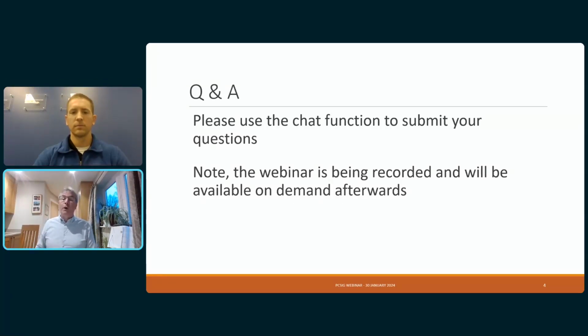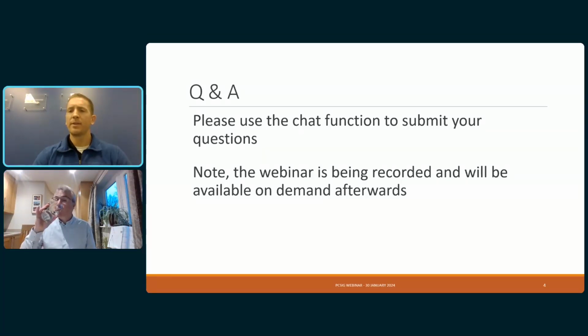A couple of questions from Matthew. Have you considered ISTA 7D shipping excursion stability experiments? Transit temps are not static. I'm not quite sure what those regs are. I'm not either. When these are shipped, traditionally, it's not going to be a bundle of samples like you'd see with plasma. It's not going to be 200 samples where sometimes they might have a device to track the temperature. This is going to be in an envelope shipped in the mail, which is how these devices are prepackaged. So I'm not sure how feasible it would be to compile all of that data for individual samples.